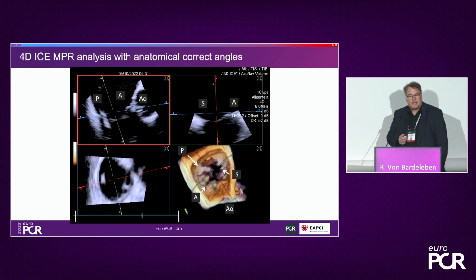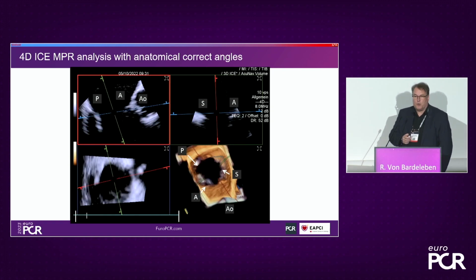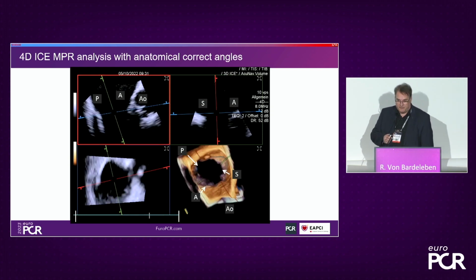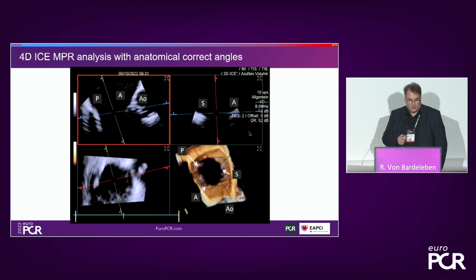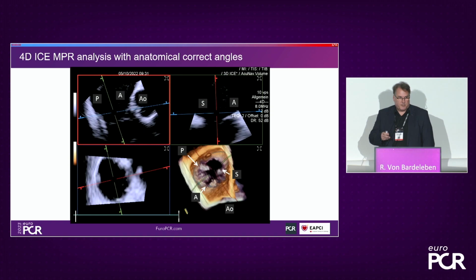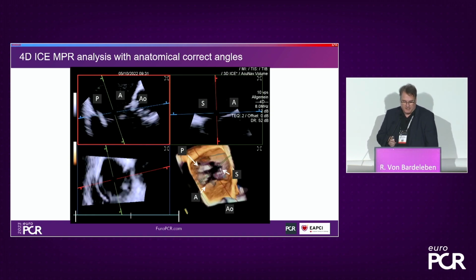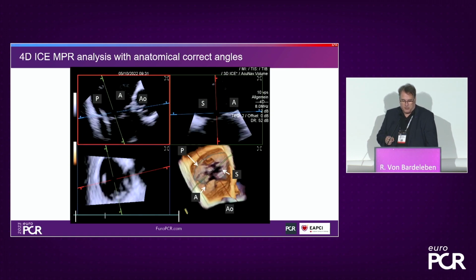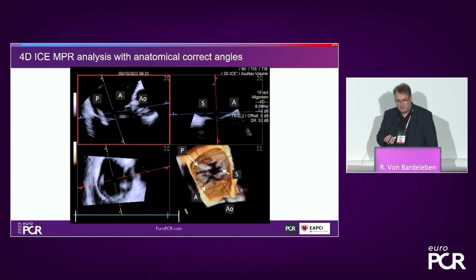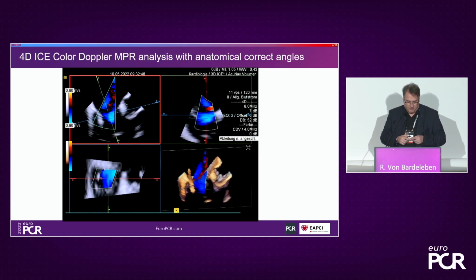The next step is then to use multiplanar reconstruction that you can see here. We can appreciate the aorta still in the image, and now we're able to rotate to any anatomically driven position that we may like. You will also see that we're able, unlike biplane imaging by TOE, always to go along with the catheter and with the arms of the TEER device. So this is an additional use. Of course, we're here not at the leaflet level of the leaflet coaptation, but we see this as a three-dimensional image at the hinge point level, so in the annulus of the tricuspid valve.